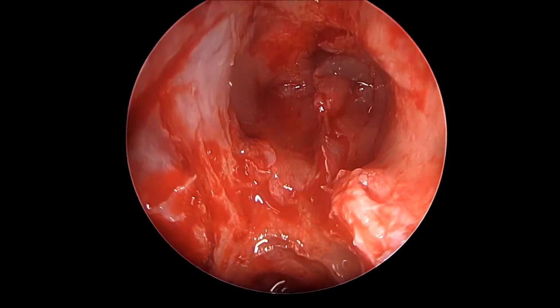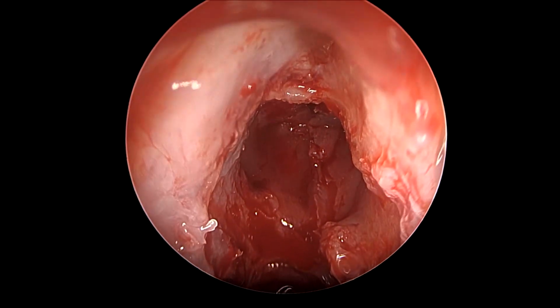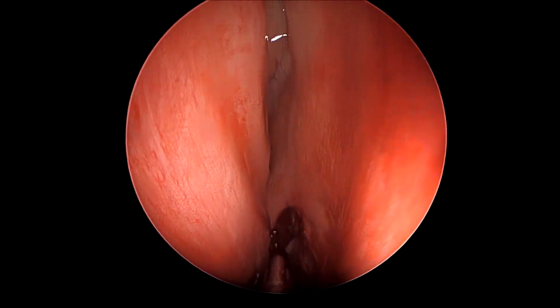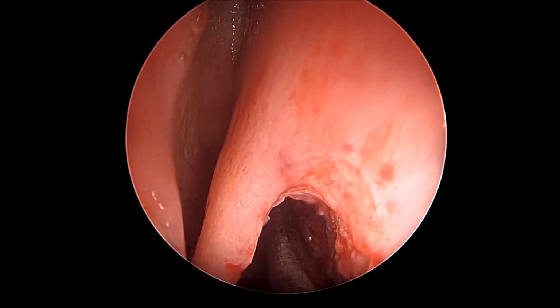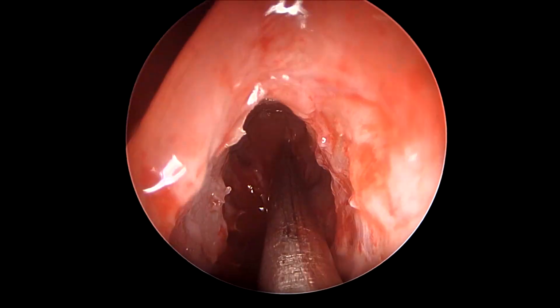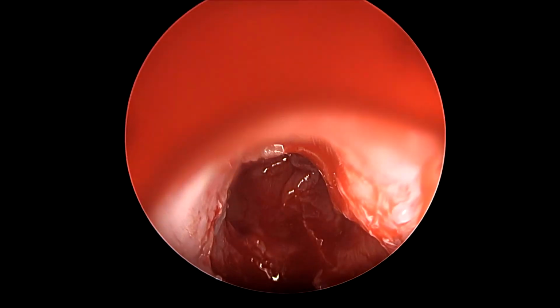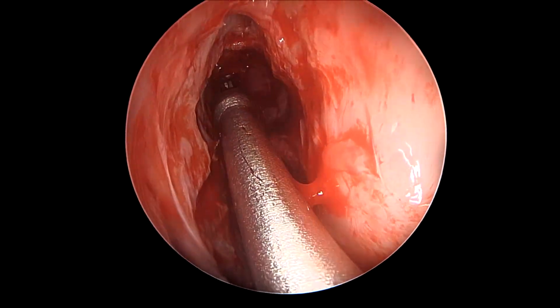This is the view inside the erstwhile opened left-sided frontal sinus, where one can see a slight part of the superior wall of the bulla cell still there, but most of it cleared, and with the frontal sinus now opening widely medial to this cell, the party wall of which has been removed. One can see how widely the frontal sinus has been opened.